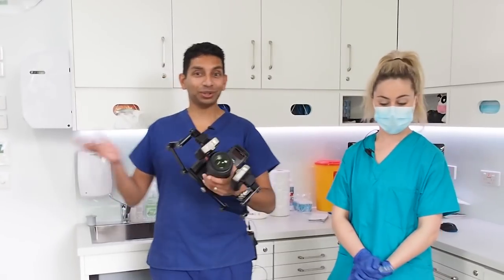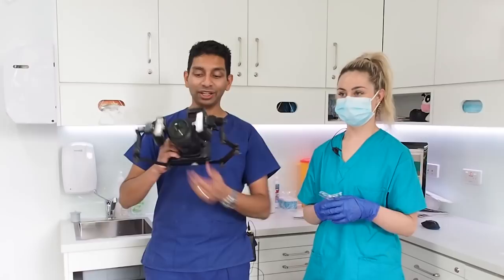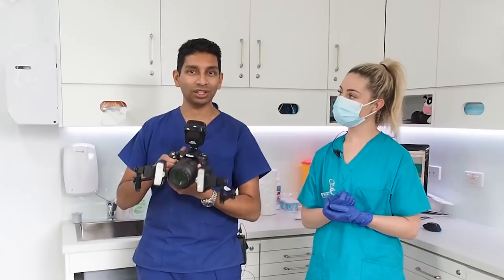Today we're going to do a quick briefing on how to take intraoral dental photography. I've got my Nikon camera here with a dual camera flash, but you do the same thing with a ring flash as well. It's all pretty much the same in terms of big picture stuff, with a few minor details which we'll go through later.